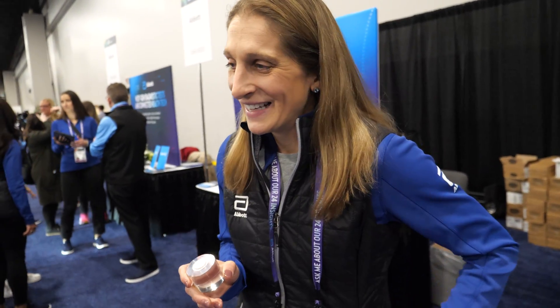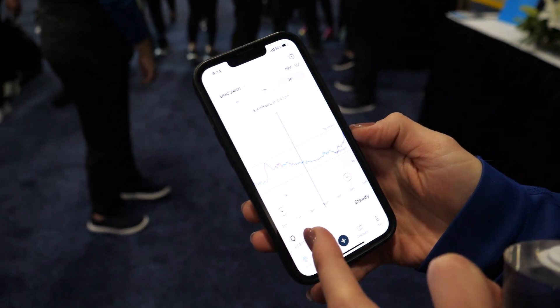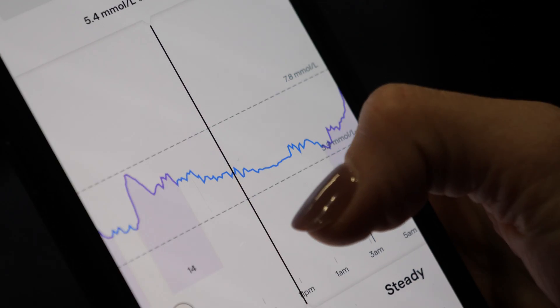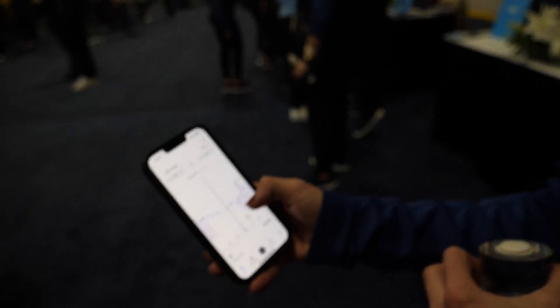Is it possible to have a look? Yes, it is possible. Well, I don't want you to see how much sugar I've consumed today — I was just eating one of our energy bars, to make it spike a little bit. The glucose levels constantly move around. So we used to have this idea that if you were not an individual with diabetes, you just kind of stayed steady all day long. But you can see in this representation there's a lot of activity. The purple is suggesting that I'm in the middle of a spike, and the blue is steadier. So across the day, you've got a lot of activity for your glucose.